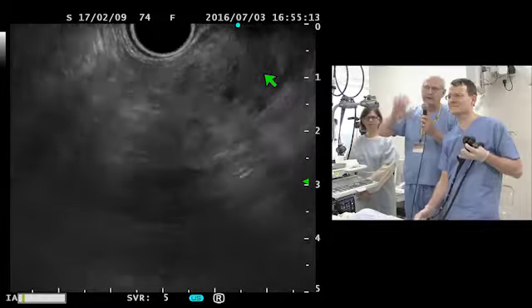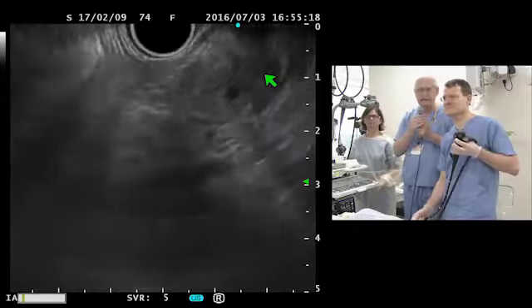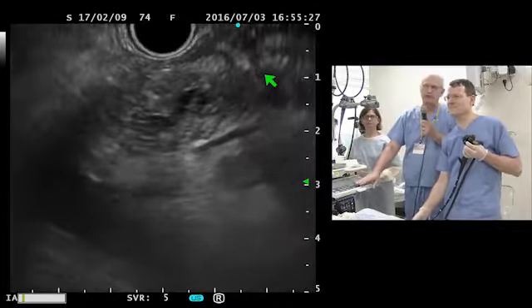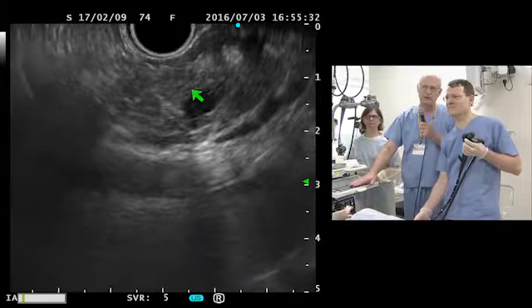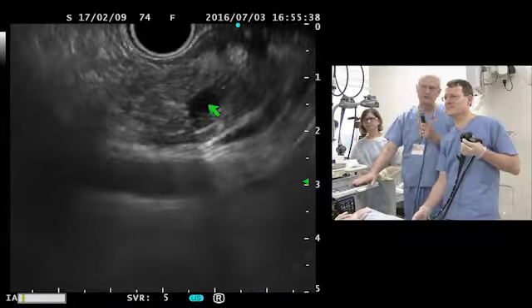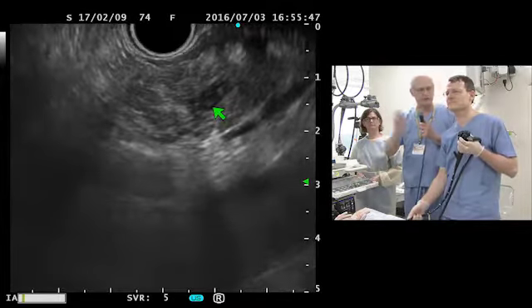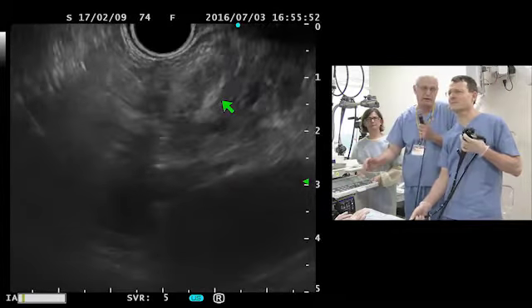If the parenchyma is not atrophied and yet you have this markedly dilated duct, it suggests that something is expanding the duct from within as opposed to an obstruction down below. If this was a cancer in the head of the pancreas causing this much dilation, I think there would be almost no pancreas around it. So to me, although the pancreas doesn't look normal, it also doesn't look like advanced chronic pancreatitis, and it also doesn't look like downstream obstruction. So I think so far this is consistent with IPMN in my view.